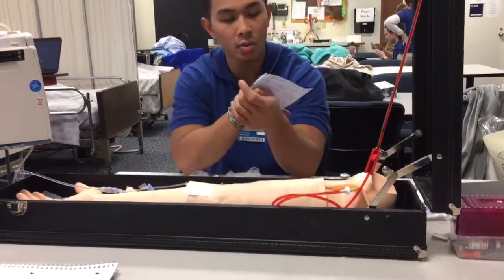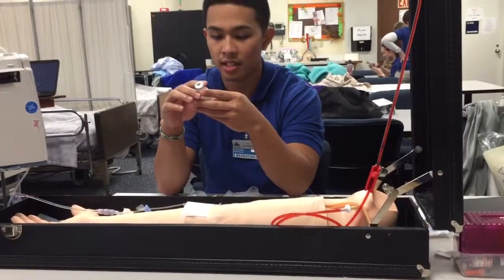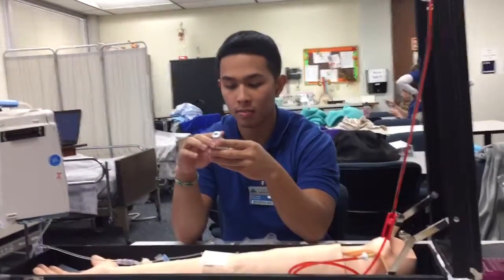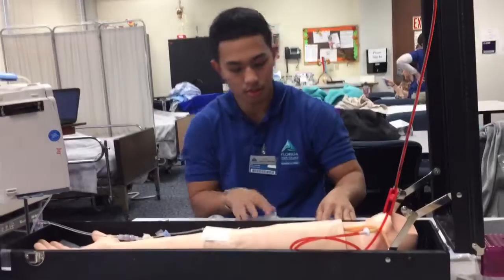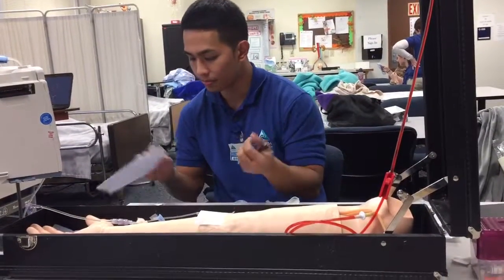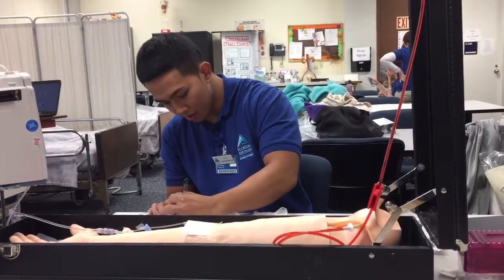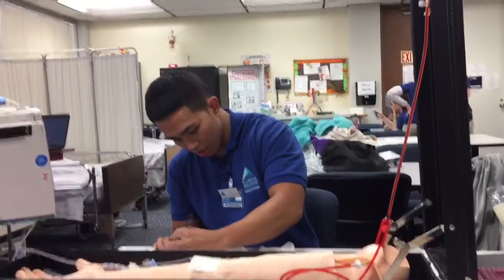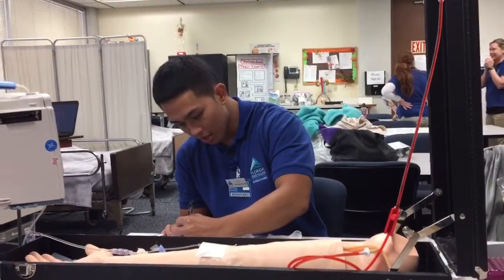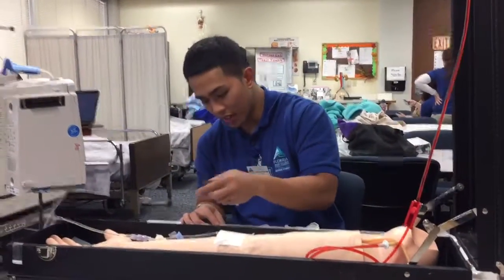So now that this checks out, we're going to go ahead and grab our medication, which is right here. This is Flagyl, and it is 500 milligrams per 1 milliliter, and the doctor orders 500 milligrams. So we're going to go ahead and do the calculations right here. 500 milligrams, X equals 500 milligrams over a milliliter. So the patient is to receive 1 milliliter of Flagyl into the mini bag.